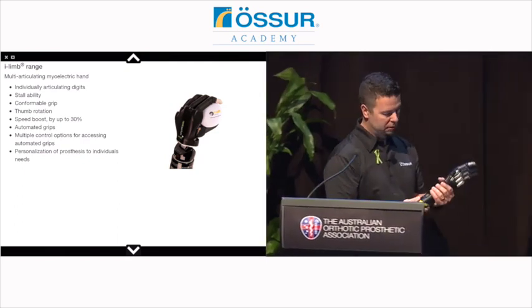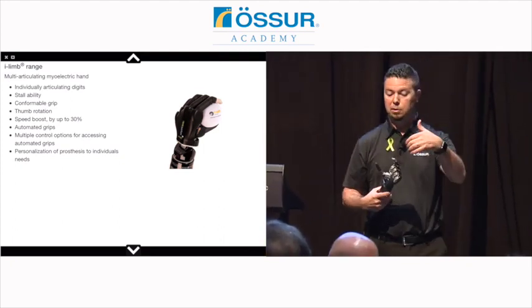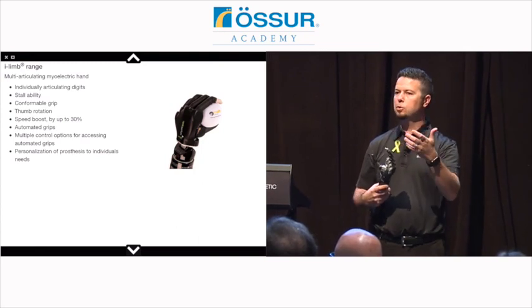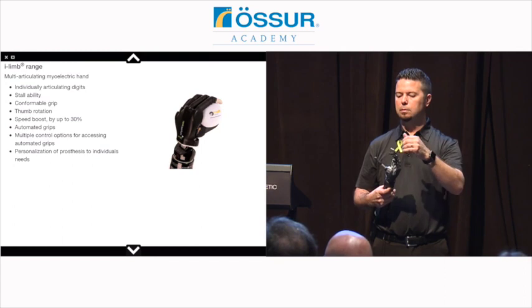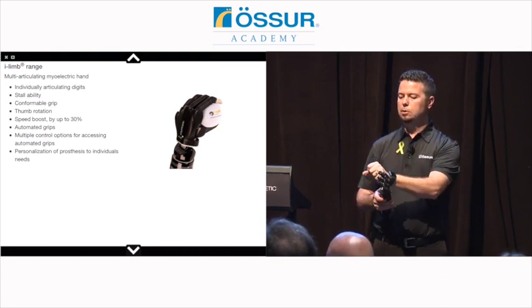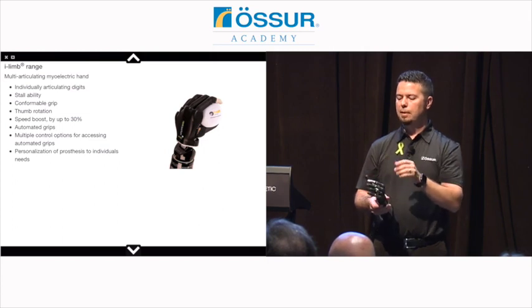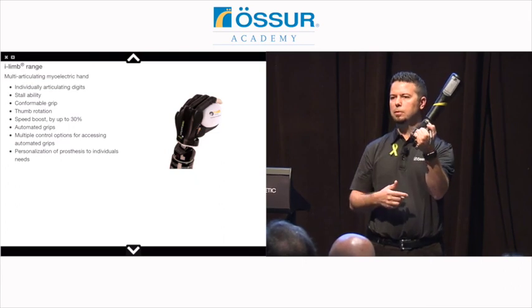you can stall fingers. And what we mean by that is as a motor comes in contact, or a finger comes in contact with an object, that motor is going to sense that resistance and it'll stop moving. So we're not relying on one motor to drive it. You can stall multiple fingers, you can stall the thumb. And that stall out ability gives us what we call compliant grip. So it's going to conform to the shape of whatever it's holding.